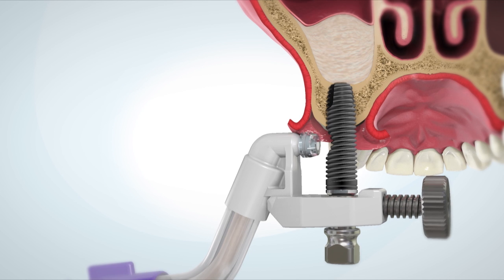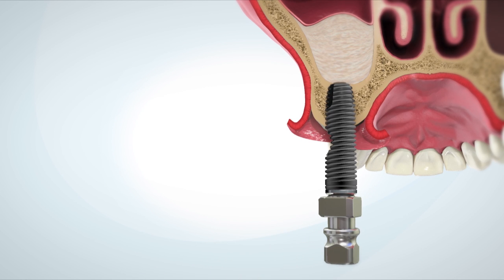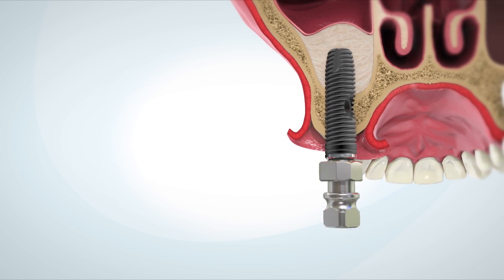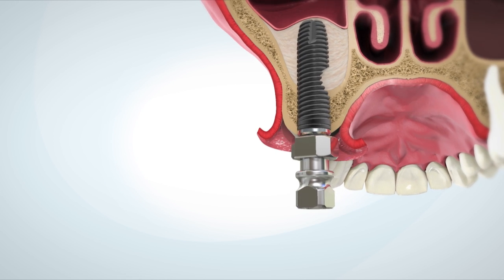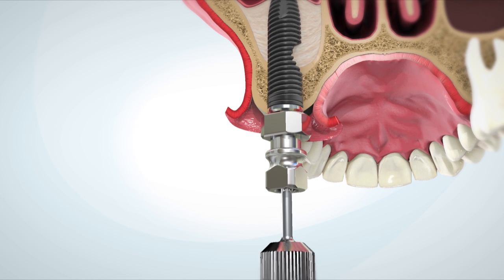Remove the tube connector from the implant. Insert the implant fully into the osteotomy. Remove the applicator.